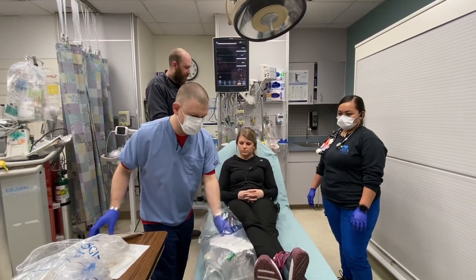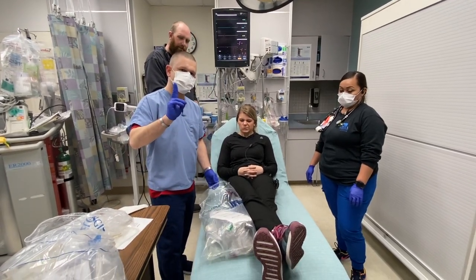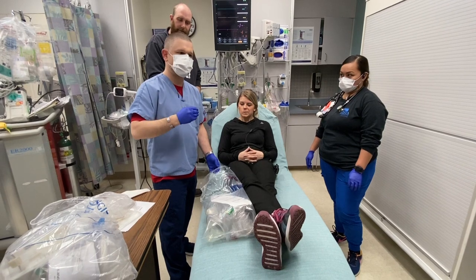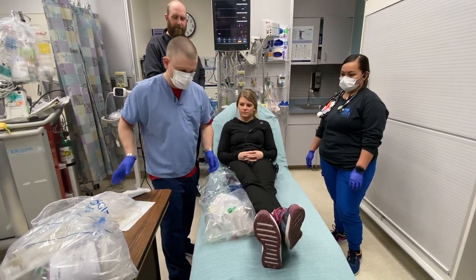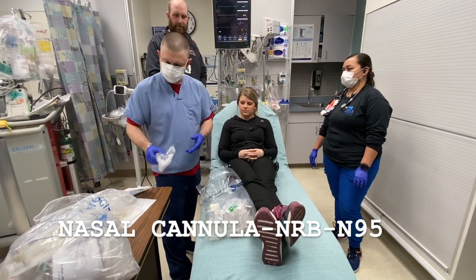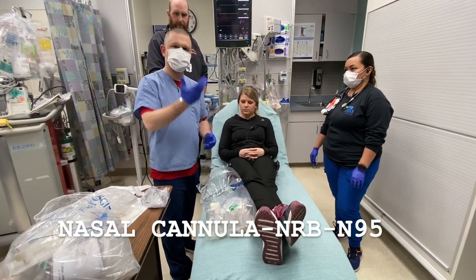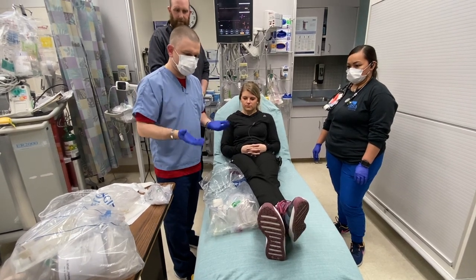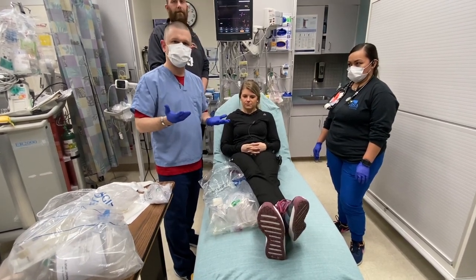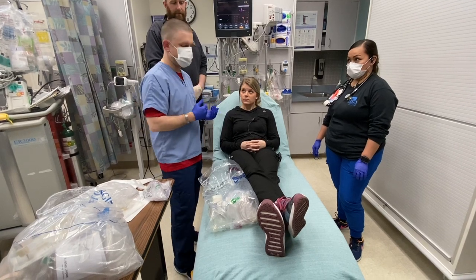There are two different modalities that you can go with for this. We have the nasal cannula with a non-rebreather over it, with an N95 over it, or you have the BVM approach, which is the one we're going to show you now.